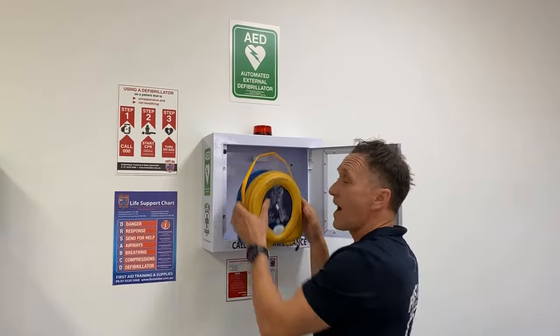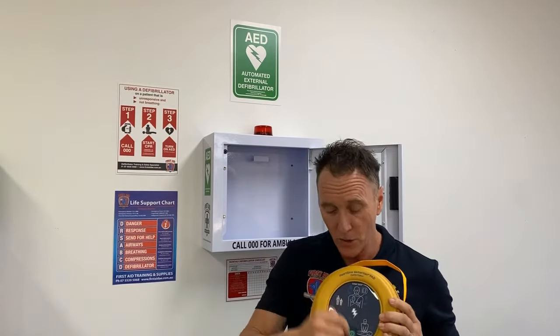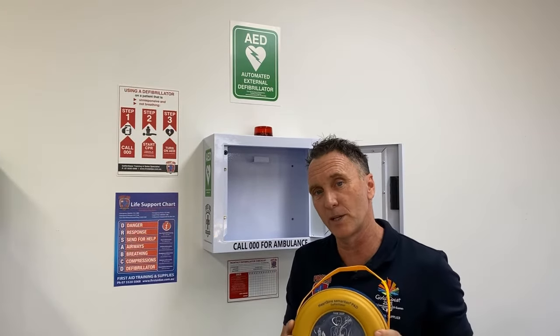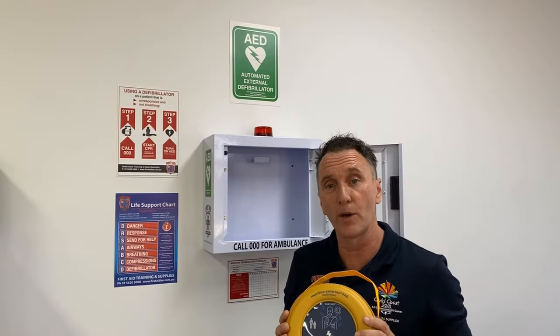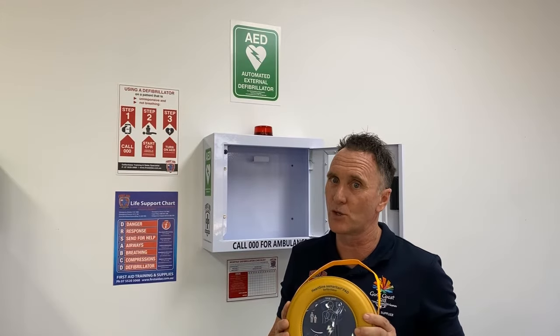And of course we have the HeartSign 360p fully automatic defibrillator. Why fully automatic? Because quite simply there is no shock button on this defibrillator — you turn it on and it works out whether it needs to shock or not. It has visual prompts to tell you to stand clear and verbal prompts as well, and it will let you know if a shock is going to be delivered and give you clear indication on your CPR by giving you a metronome, helping the rescuer in this emergency situation.